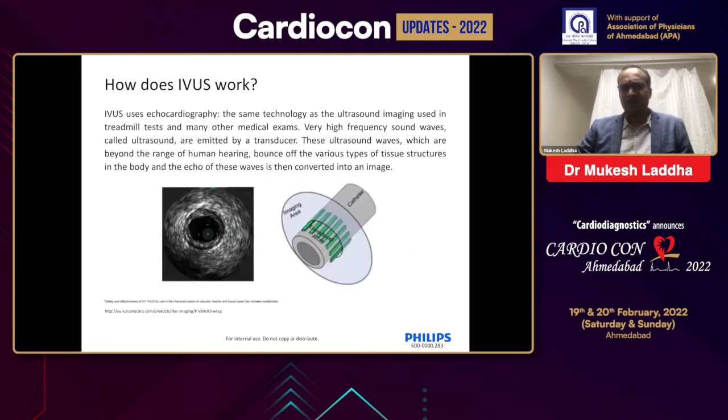Now, how does it work? As I told, this is just a normal ultrasound, and the same principle we use in echocardiography is applied here also. The ultrasound wave is emitted by the transducer and ultimately reflected in terms of images, and the software converts those images into real-world images for our interpretation. So these are just normal ultrasound mechanics, and that is totally incorporated in this wonderful technique.